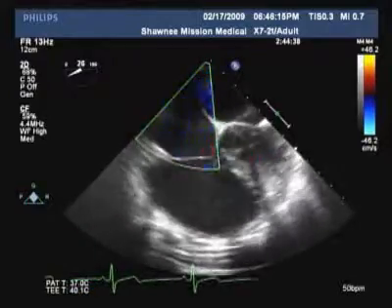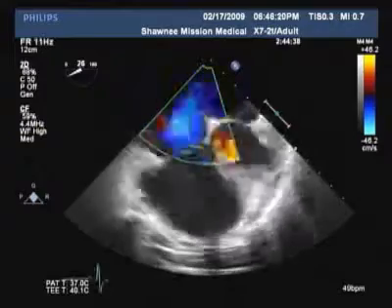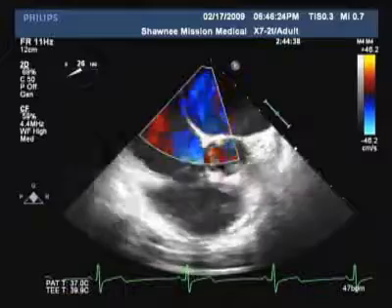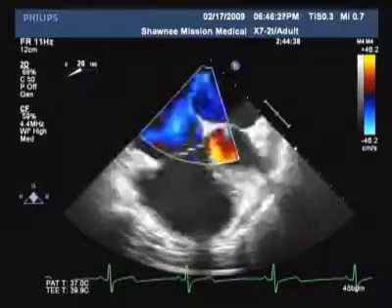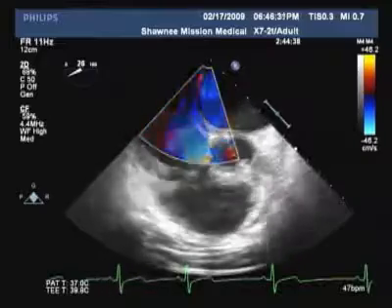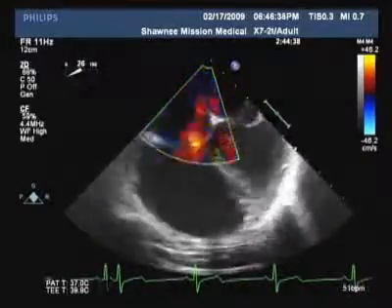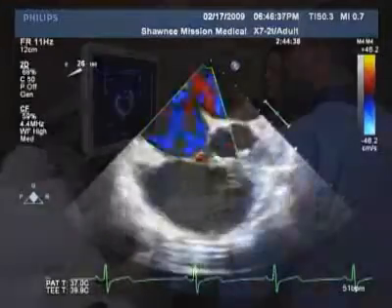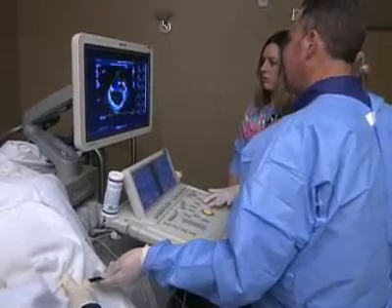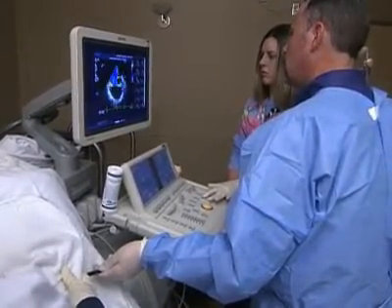We always look on transesophageal echocardiogram because if you have a hole there, it's a way for a piece of plaque or something that would normally be filtered out through the lungs to go across, and again, a way to cause a stroke. You have then a potential blood clot or plaque that goes through that patent foramen ovale and goes up to the brain or goes to the extremities and causes a lot of problems. So another good thing to look for, if people are having recurrent strokes or mini strokes called TIAs, we can look at this area and see if there's any problems with basically a hole in the heart.